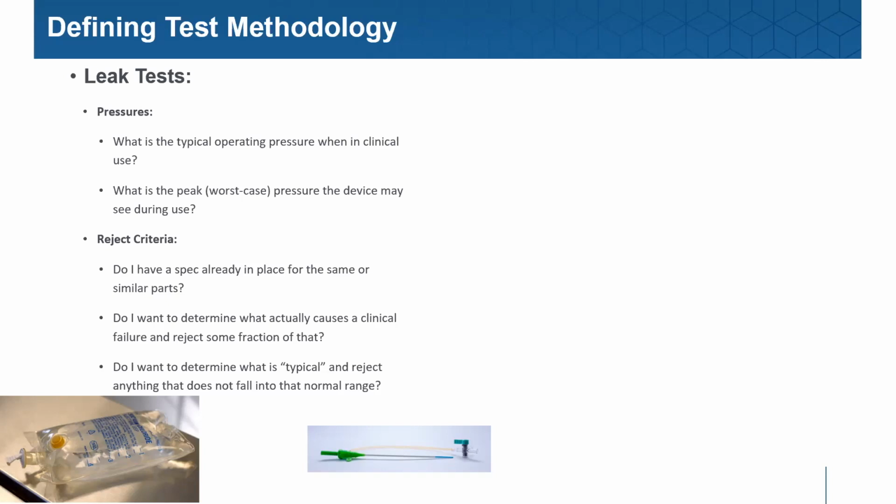And I would see almost no decay on the large tank, because there are so many air molecules and so much air mass inside of that, I need to lose a significant amount of air before I see the pressure start to dip. Volume is supremely important with pressure decay testing. Well, converting that to a leak rate allows you to level the playing field and identify what loss rate, not based upon purely what's inside the part, but how much loss of air equals a field failure.